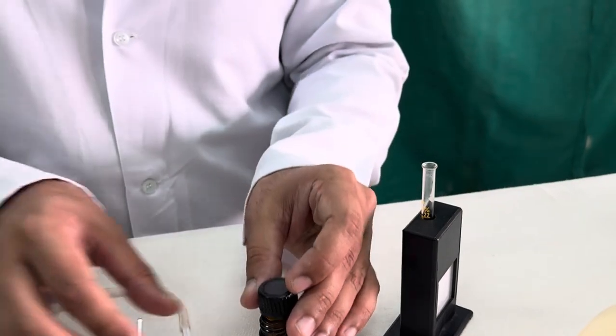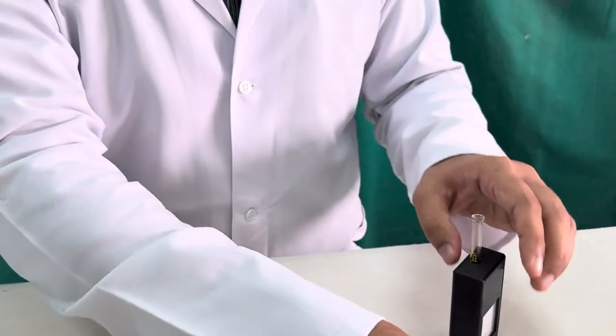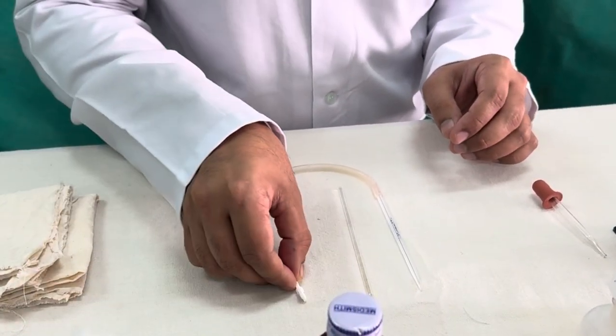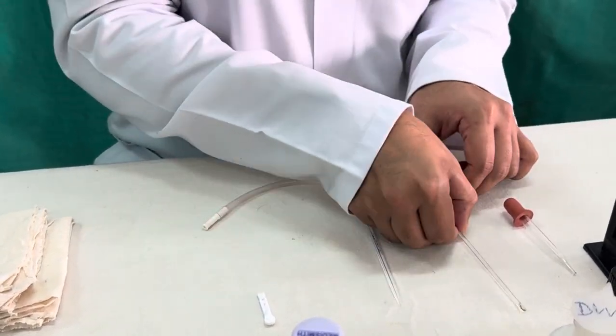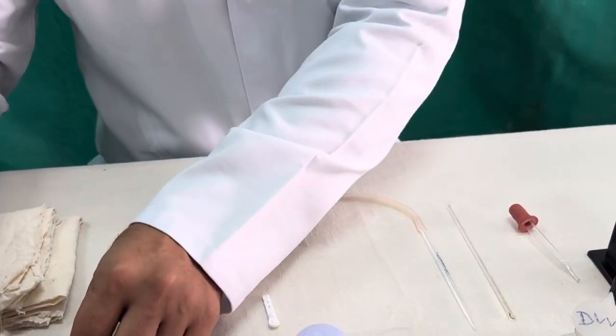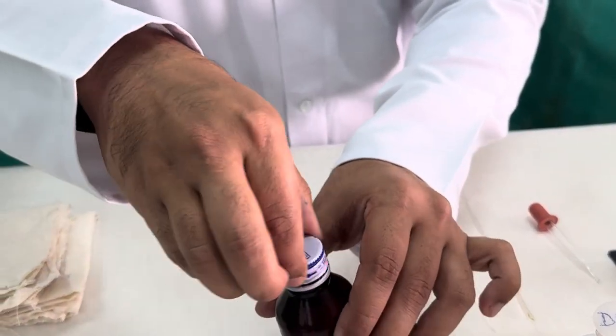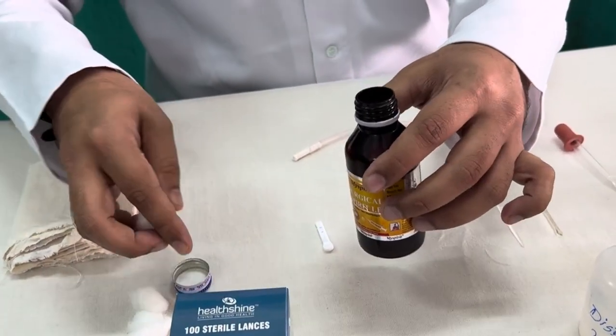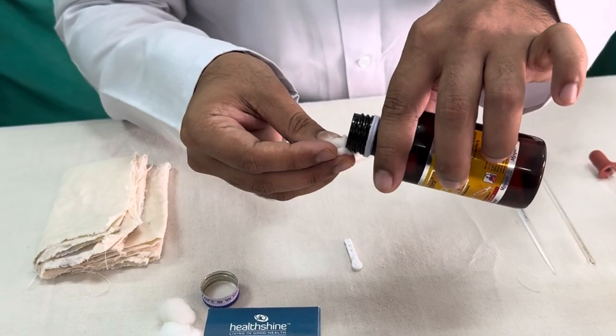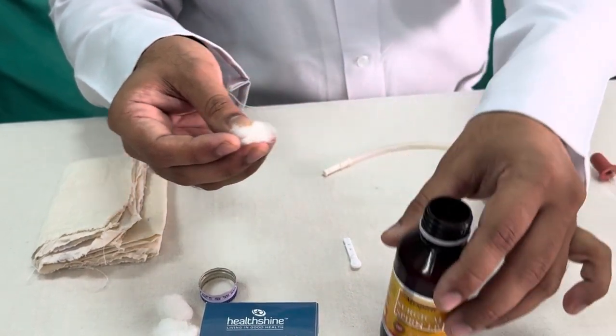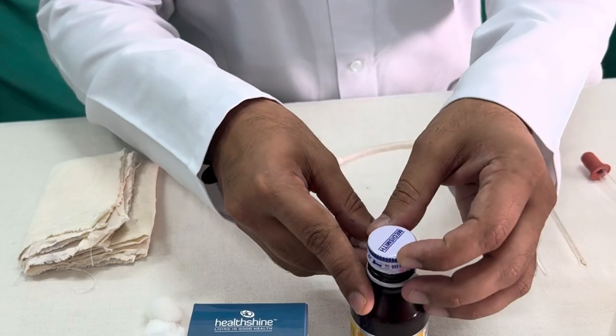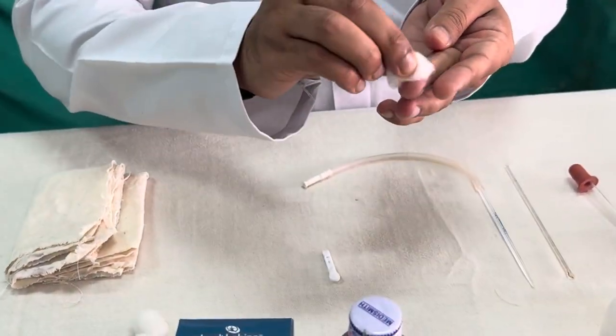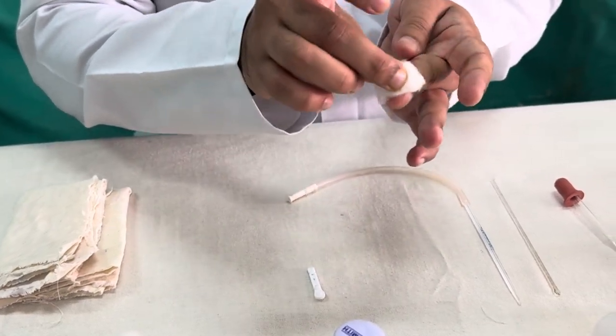Now once we have placed that, now with aseptic precautions we will prick the finger, preferably ring finger or the middle finger, with aseptic precautions. For that you should use a cotton swab or gauze piece and just pour a small amount of the spirit and wipe it out on the fingertip and allow it to dry.